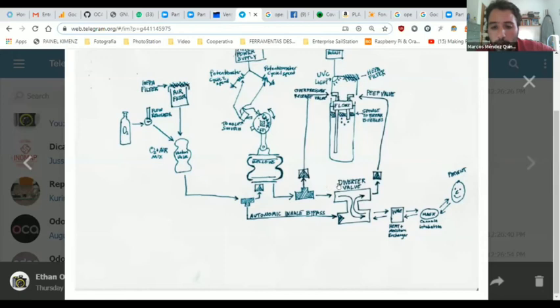And if in some case the patient is trying to blow out the air, this check valve here will maintain a pressure in a tank, at whatever the doctor establishes as a maximum pressure for this patient. For example, 30 centimeters of water or 35. So if the patient tries to breathe out, the air of the bellow will be diverted to this tank.